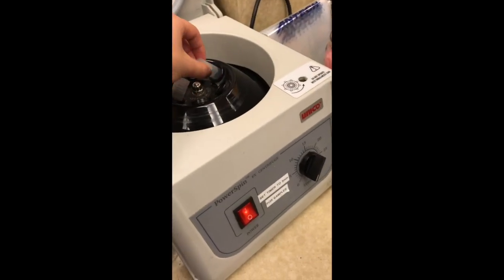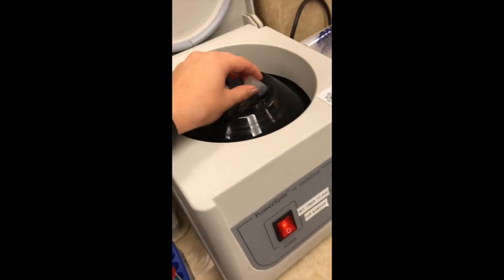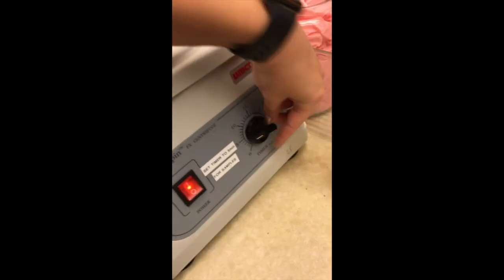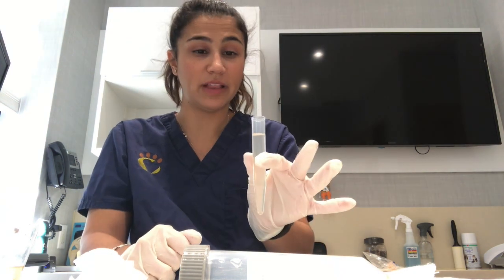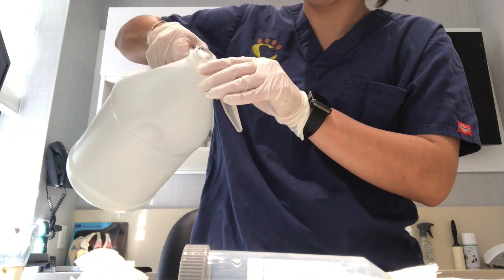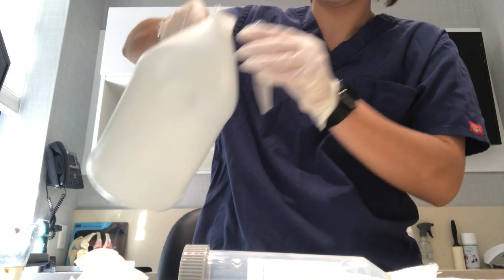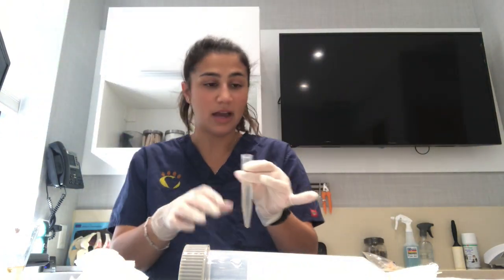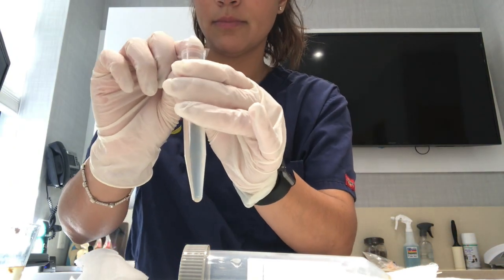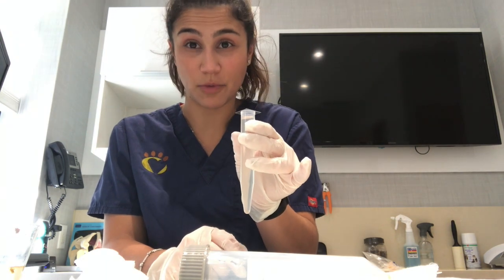So I have my fecal float here and another tube to evenly distribute it. I will close it and centrifuge it for 5 minutes. Okay, so I just centrifuged my sample for 5 minutes, and now I will fill it up just to the top, just to form a little meniscus. Perfect. And now at this point, I'm going to place a cover slip on top. We'll allow it to sit for 10 to 15 more minutes.